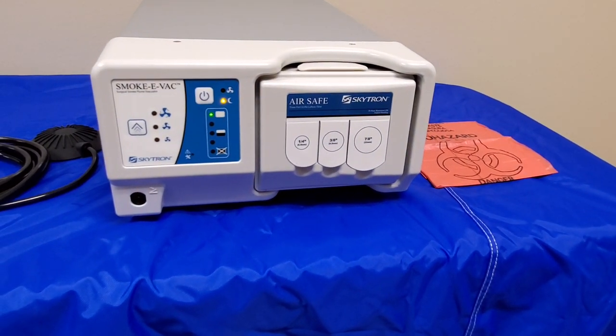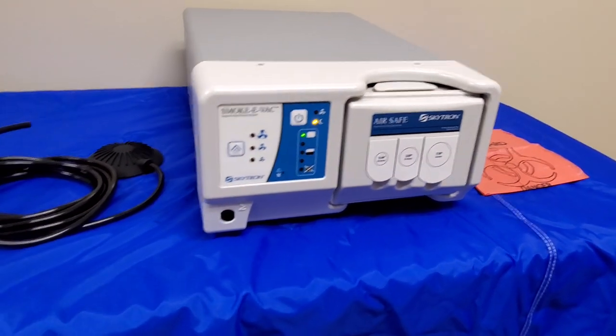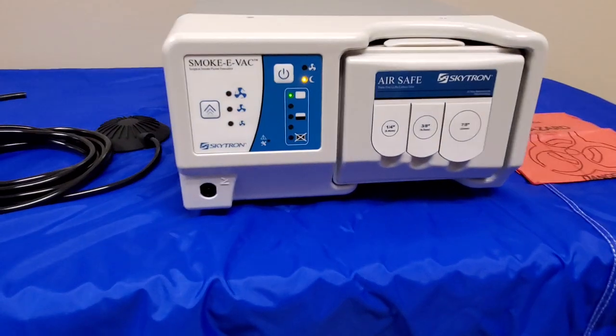And put it back into standby mode. That is basically an overview of this system.